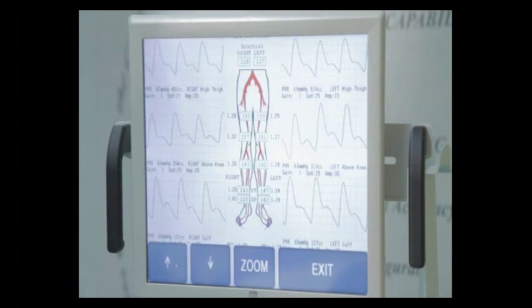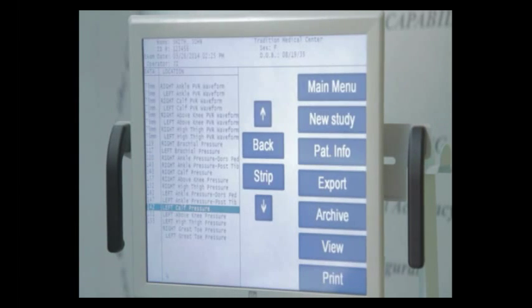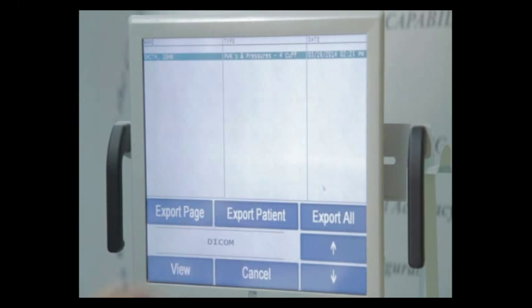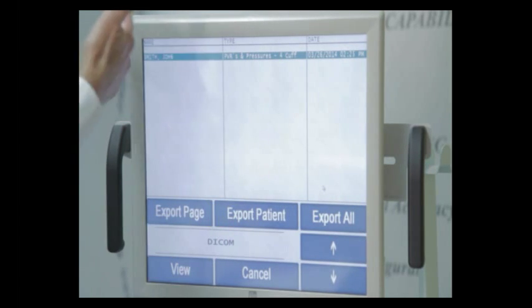What I like to do first is send my study to PACS and then print it and then archive it. So to get to those steps, simply press Exit, Exit again, and then you can export by pressing this button here. And when you press the export button, you can export that page to PACS, or if you had several studies on that patient, maybe a history page and a post-exercise, export patient will send all 3 studies over at once. Or if you had multiple patients that were not sent to PACS, you can use the export all button.